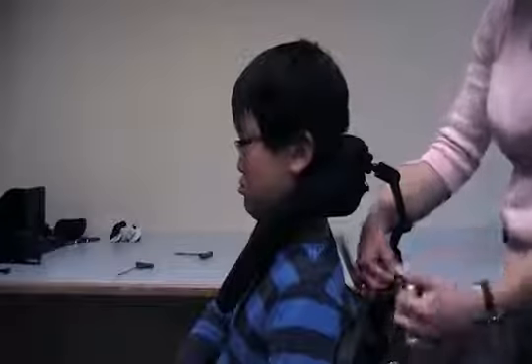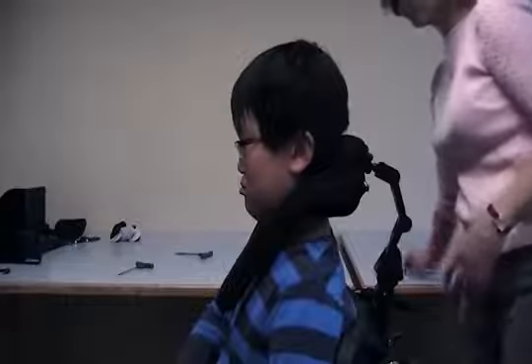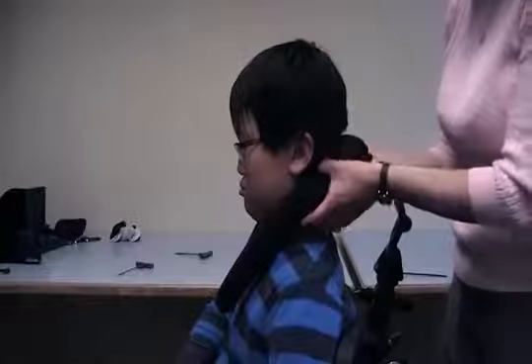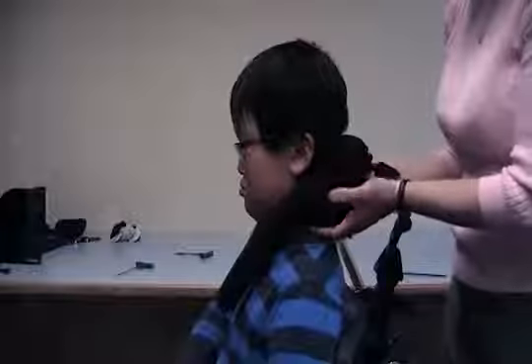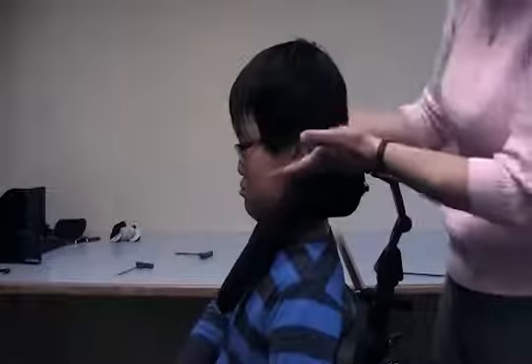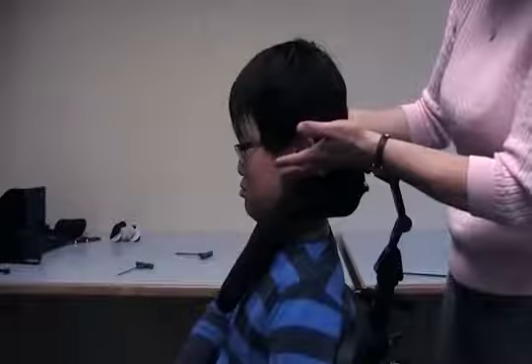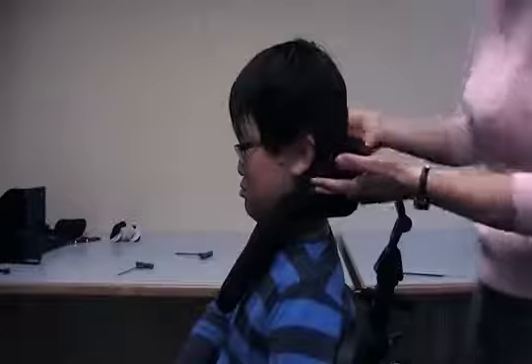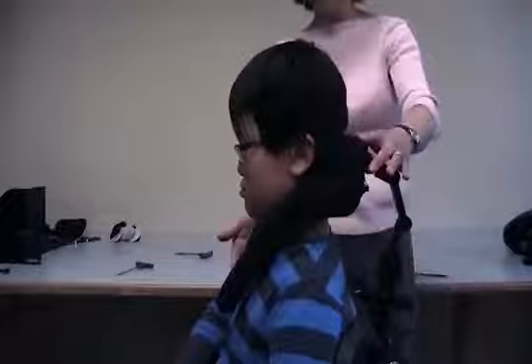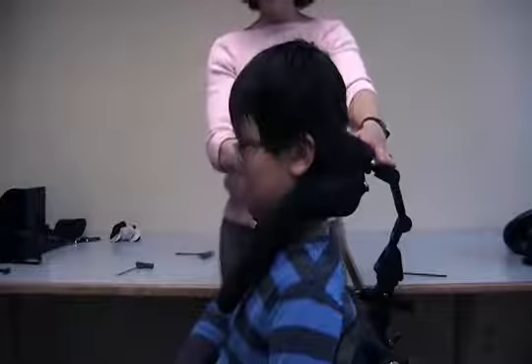Once you have achieved the general position, it's important to feel and ensure that this is contacting the suboccipital area, that there is no pressure on the ears. Ear cutouts can be ordered with this as well, and that the client's head is aligned.